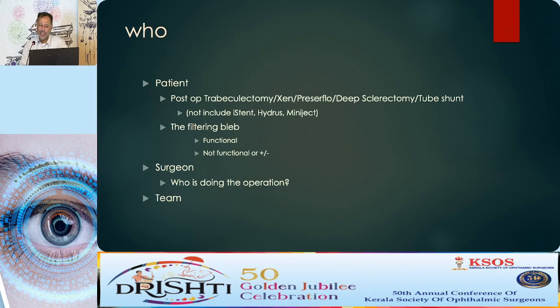So blebs can be associated with any of these operations that are here on this list. And I'm therefore not deliberately including all the microsurgeries that we do these days. It's also important to make an assessment of the bleb to make sure whether there's a nicely functioning bleb or whether it's a so-so bleb or a failing bleb. Then, of course, your strategy changes a little bit.